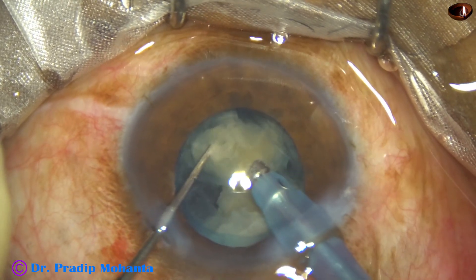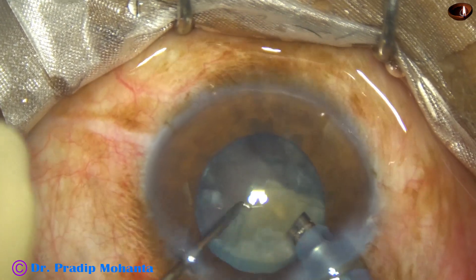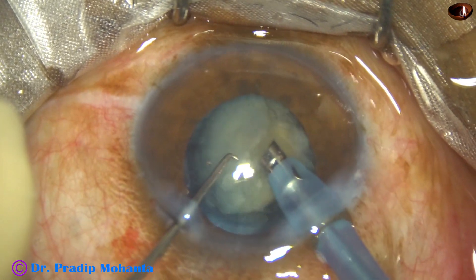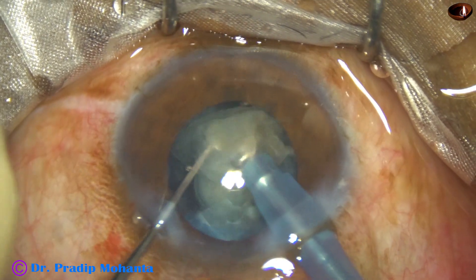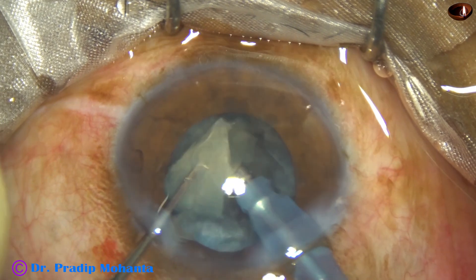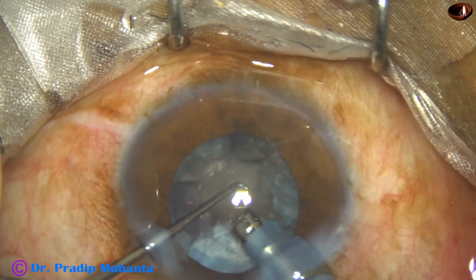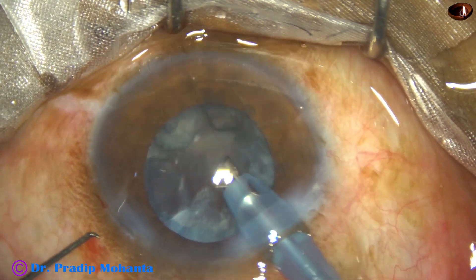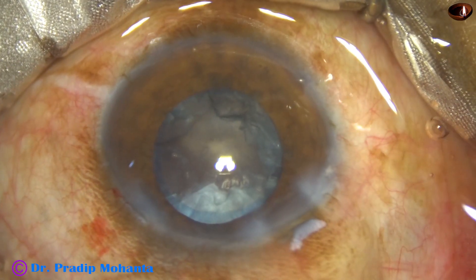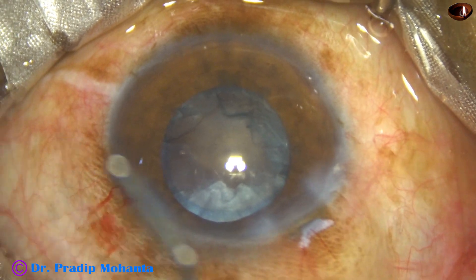The bottle height is a little more in this case. The silicone oil in the vitreous cavity always pushes the posterior capsule up towards the cornea, and that has to be neutralized by the fluid pressure. So the bottle height is more in this case — it is 101 centimeters.